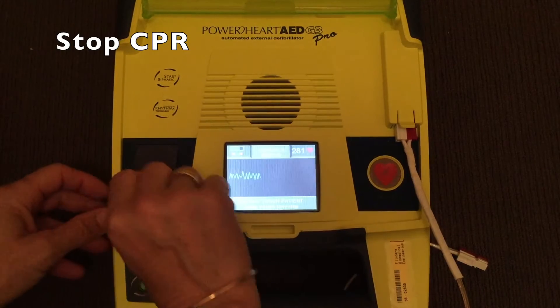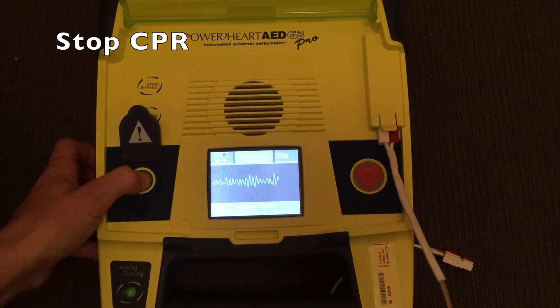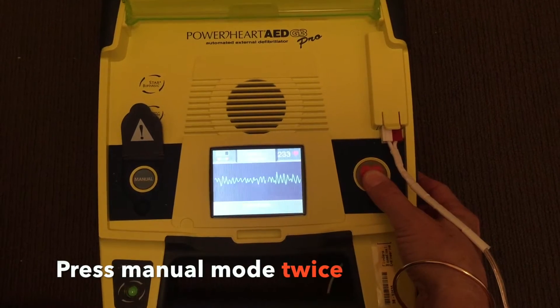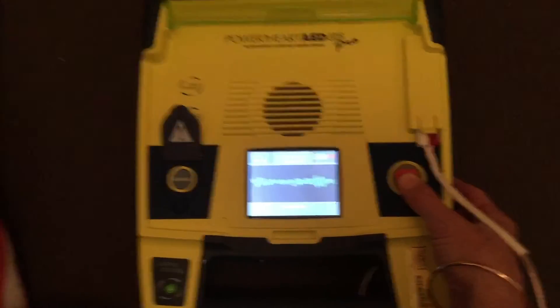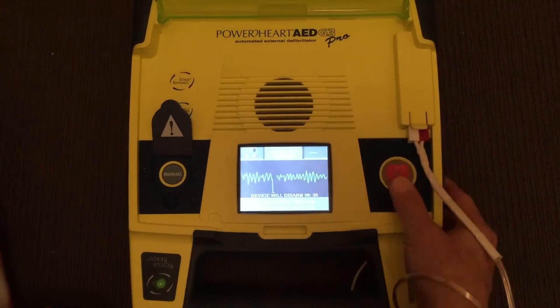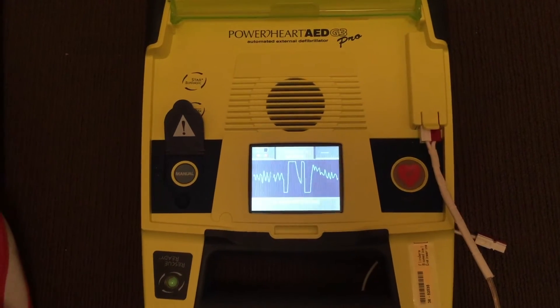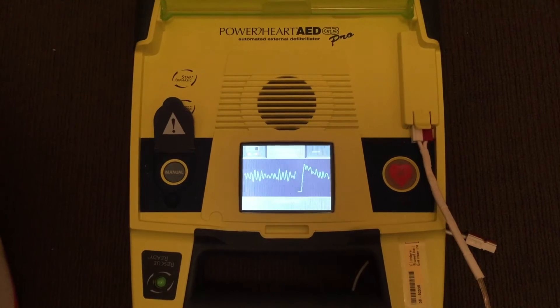Do not touch patient. Shockable rhythm. Entering manual mode. Oxygen away. Everyone clear. Top, middle, bottom. Stand clear. Charging. Shock delivered. Start CPR. Give 30 compressions, then give two breaths.